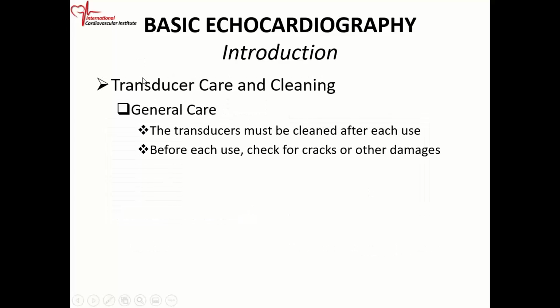So we come now to transducer care and cleaning. If you're doing a transthoracic echo, you put the probe on the patient's chest, and the probe is exposed to body fluids and the like. So it's important to clean the probe after each use. After you finish one patient, you should clean the probe. The transducers must be cleaned after each use.